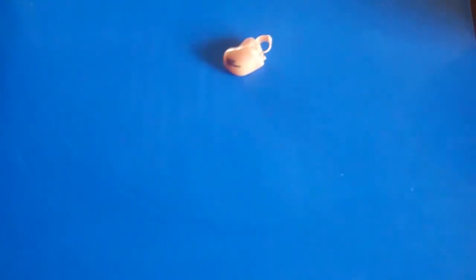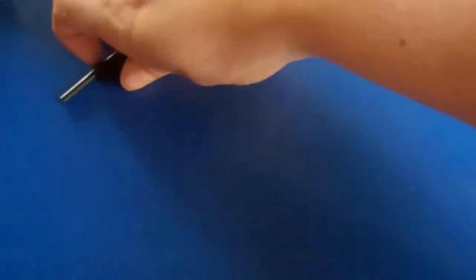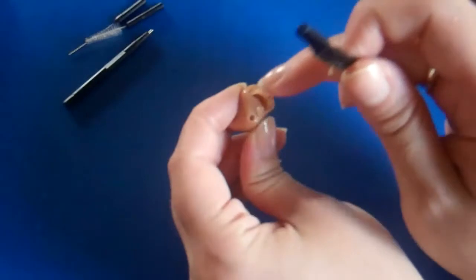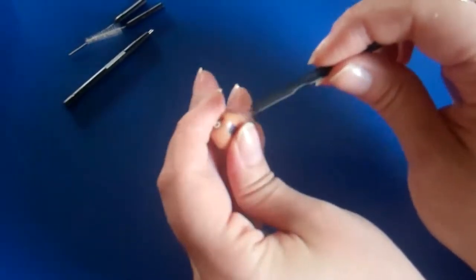When you first get your hearing aids, you are given a little kit with tools inside. These tools are to help you clean it, and they look like this. Probably the most important tool is going to be your brush. This brush is used anywhere on the hearing aid that you may see debris or wax.